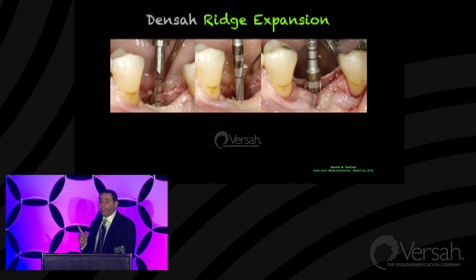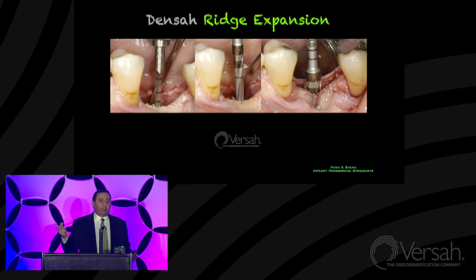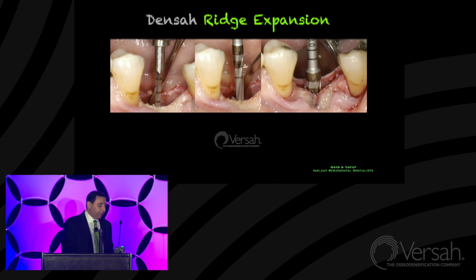If we look at the slide on the right side, you know that that bone is gone. Whatever is there is just nothing but a resorbable membrane that will resorb. So we have to plan on augmenting that area. Once that is expanded, you can see sometimes you get microfractures. Anybody who has done ridge expansion or ridge split has seen this happen, and I'm sure all of us have learned the hard way on some of those cases.